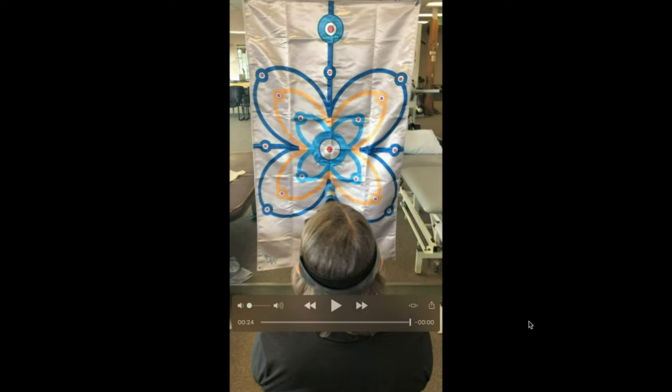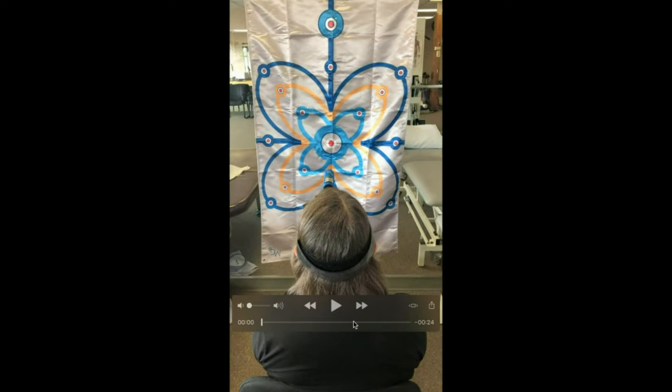All right, so let's play that again and let's break this down a little bit. A couple things that you might have noticed when we're doing this: distance measurements. I actually haven't ironed out the folds in my flags. I've noticed that it actually gives me another distance measurement that I can see very easily, although these iron out pretty quickly on low heat, if you have that personality type, I guess. I do have the laser so far up that she can't really see it. It's not under her field of vision as she's going back and forth.